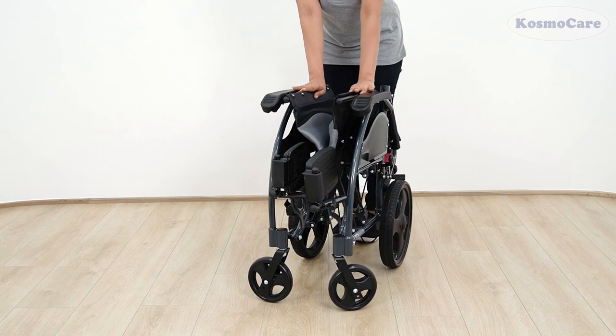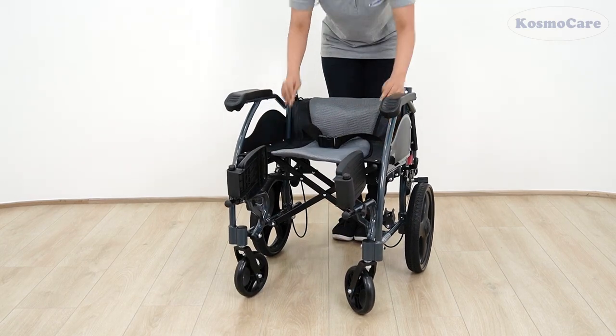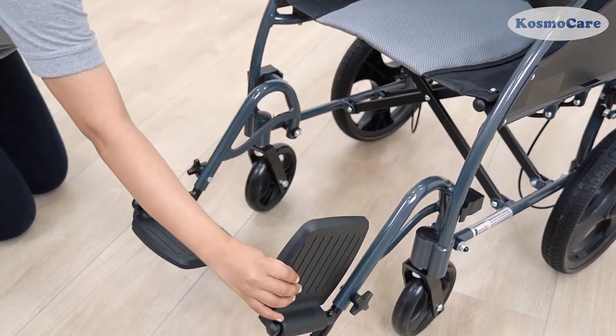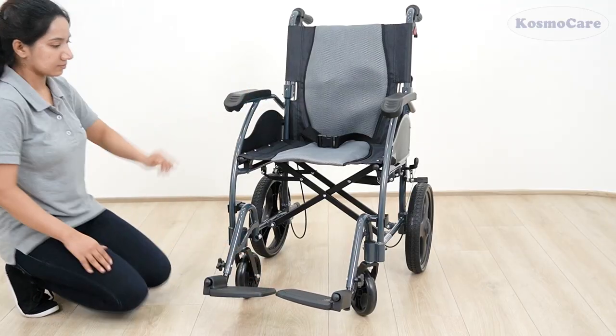The wheelchair comes pre-assembled. Simply push down on the sides of the seat and lift up the backrest until you hear a click sound. Flip down the footrest to unfold the wheelchair.